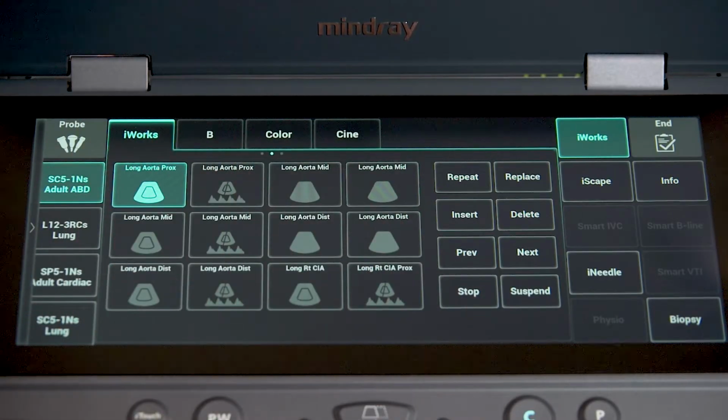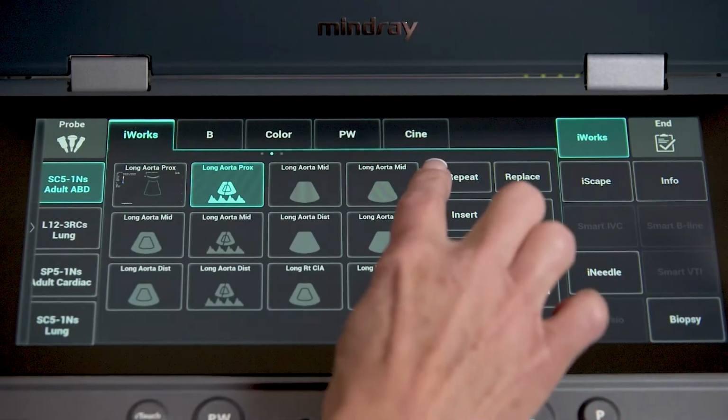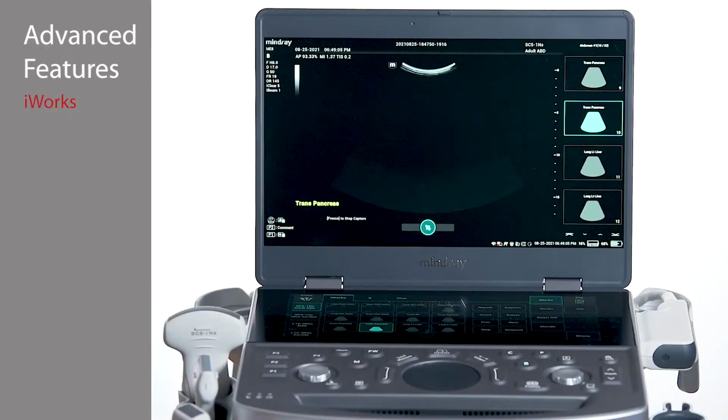iWorks is designed to offer flexibility while scanning. To the right of the views on the touch panel, there are tabs available to repeat, replace, insert, and delete a view. There is also the option to pause the iWorks protocol if needed and resume later.